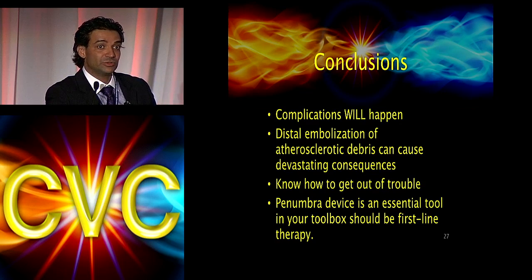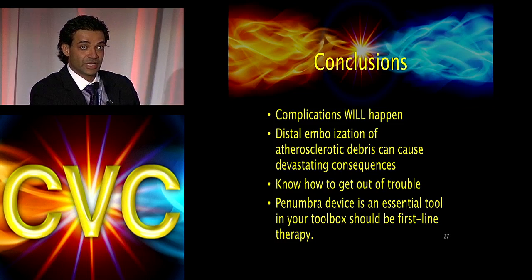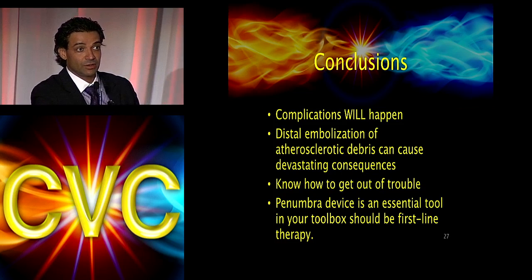Balloon angioplasty is always the wrong answer. It's never the correct answer, because you'll pretty much either push that down, or you will just push it up against the vessel wall. Then when you deflate, it's just going to come right back.